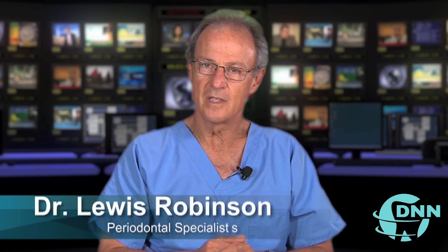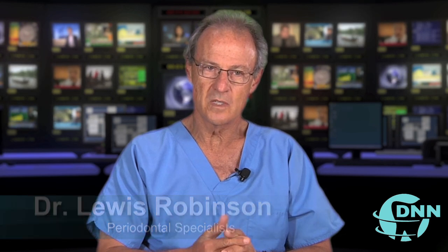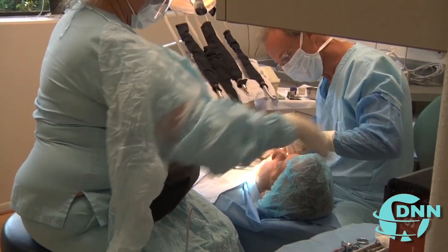So we hear a lot of advertisements, especially recently, on same-day dental implants. Is that really possible? It is actually. It's pretty remarkable technology. Historically, the paradigm for dental implant placement was to place an implant, or a fixture as it's called in our profession. We would wait then 3 to 6 months, and then we would come back in and do the restorative treatment phase, which means we would make the tooth that fits on top of the dental implant.